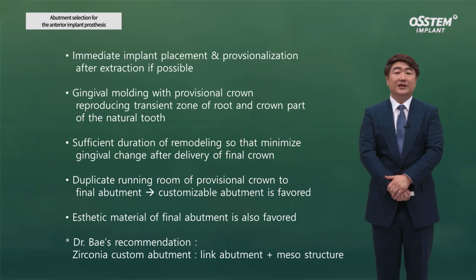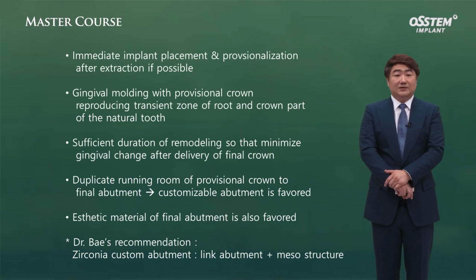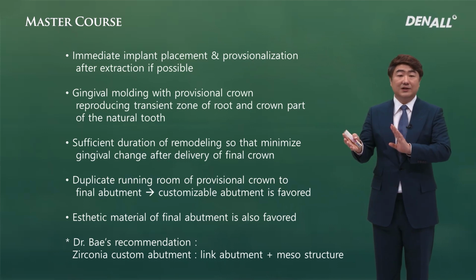Also, the provisional created the running room to imitate in the final. The running room is not symmetrical. Therefore, it's better to use a customizable abutment, and the color impacts aesthetics.